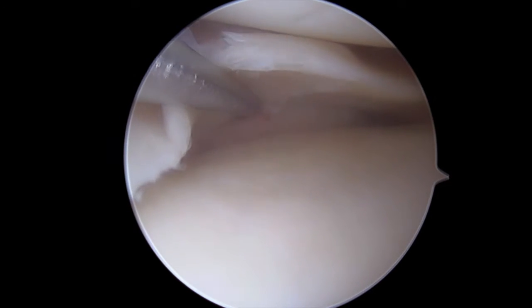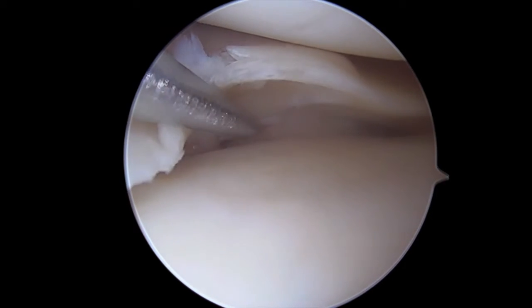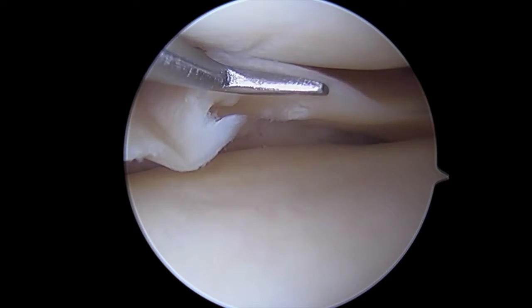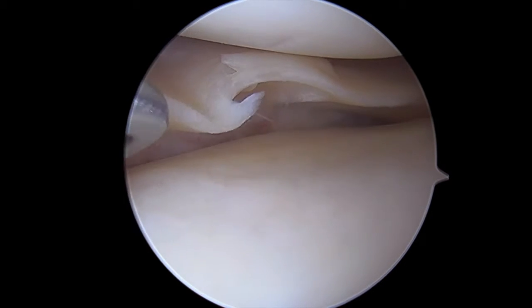We have a vertical component along the meniscal capsular junction, and a radial split as we move towards the white-white zone. Looking at how the meniscus has lost its normal contour, we can surmise that there's at the very least a horizontal cleavage plane tear in here, along with a second vertical component that's almost trying to become another radial split.